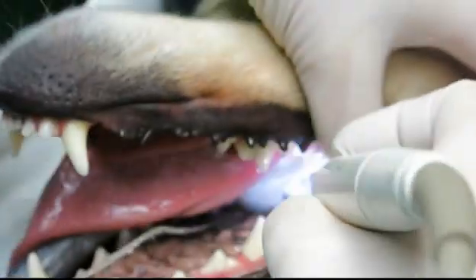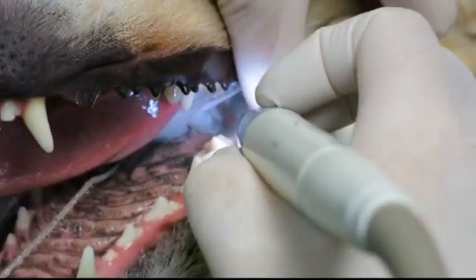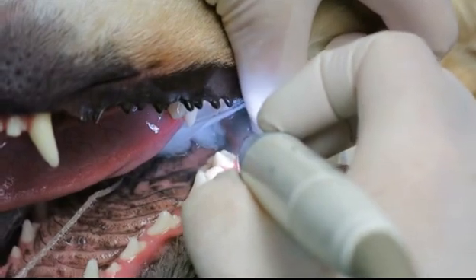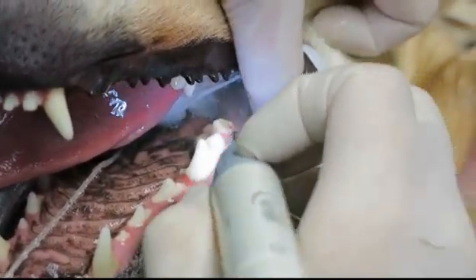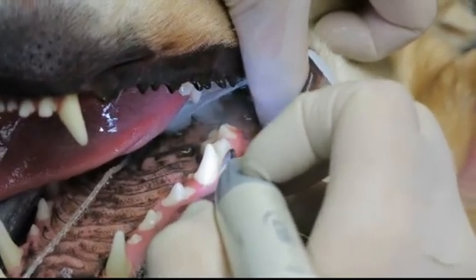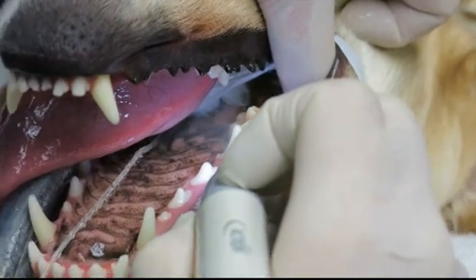Now I'm going to go under the gum line and clean the pockets — it's called the sulcus because it's normal. I'm going to take away all of the tartar from underneath the gum line with this ultrasonic scaler.